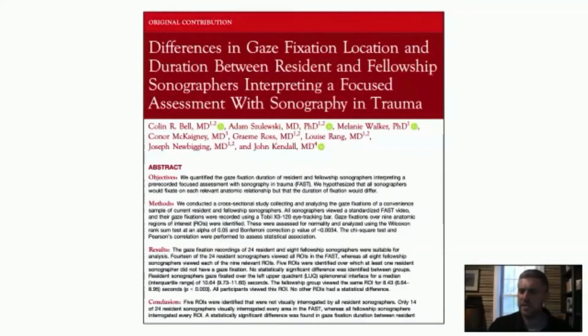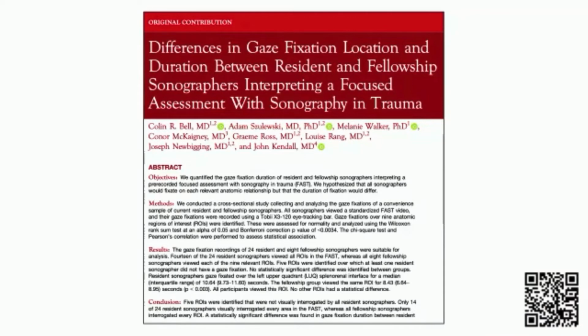And so that brings us to this study, right? This is a study we did. I'll turn myself off so you can see the QR code. This is a study we talked about a couple months ago in the Ultrasound Fellows Journal Club, and I thought it was really interesting to see where novice trainees, where residents and fellows, look when they're doing the FAST exam. Because we know where we're supposed to see stuff, so where are people looking when they do this study? Are they looking at all the right places? And if not, where are those places they're not looking, so that we can circle back and say, hey, we should probably have you look here, right? So that was really an interesting study.